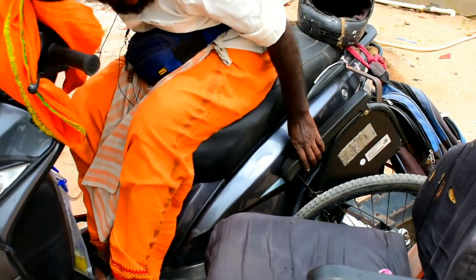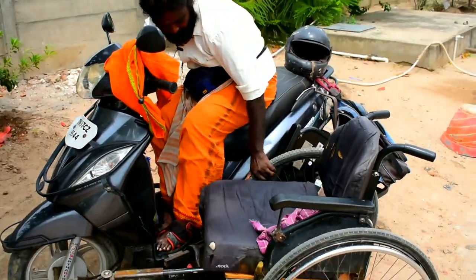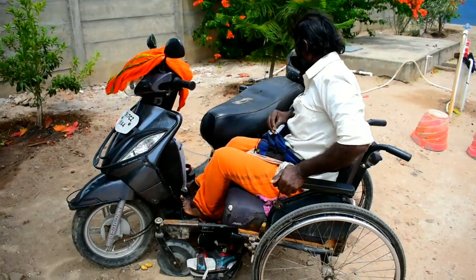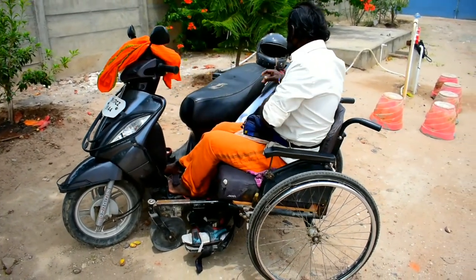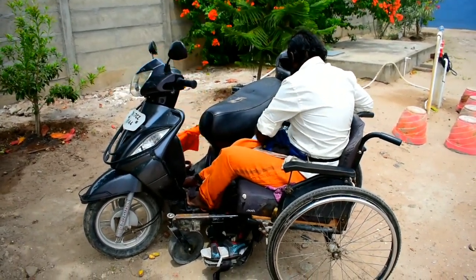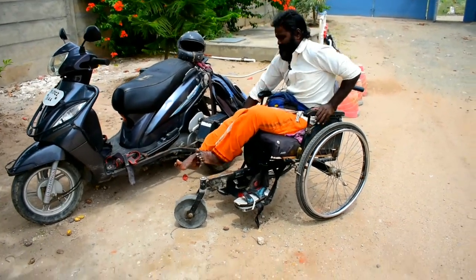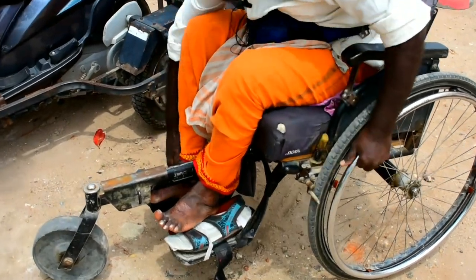The basic thing you are seeing here is the strap or sandal which is attached to the scooter and the wheelchair. This is because even though we reduce the spasticity to a certain level, there is what's called diurnal variation — it can vary; sometimes it is exaggerated and sometimes it is reduced. You can see his limb how it goes into flexors and keeps on extending — that is the severe spasticity.